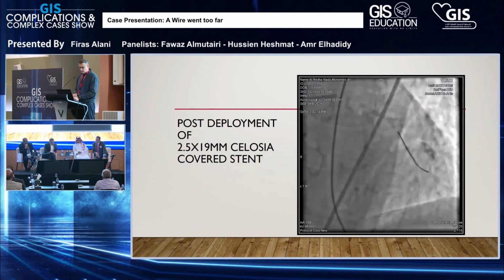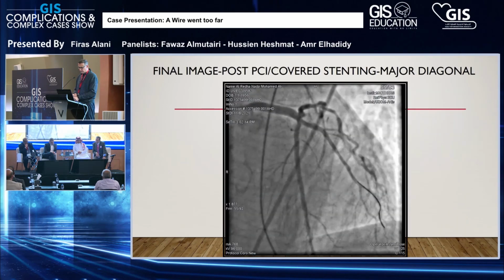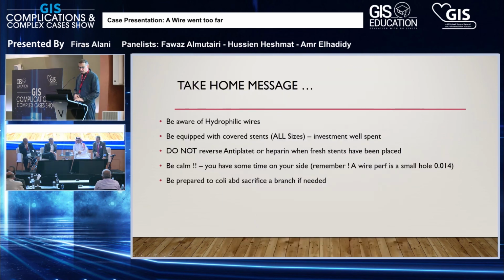And then finally we got a final result here. The stent, I will say, got stuck somewhere here in the left main and had to take off right at the knuckle of the diagonal, but with the grace of God, it went through nicely.